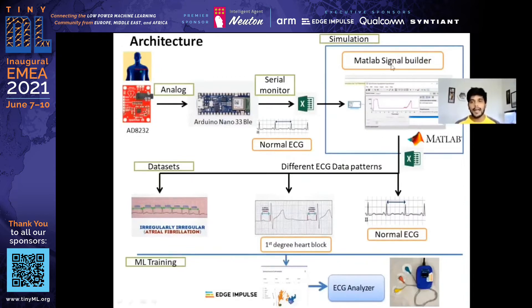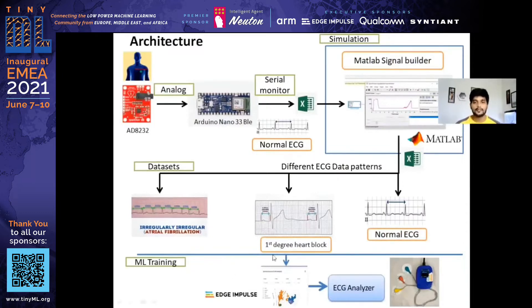I used MATLAB Signal Builder to modify the normal ECG data to look like a first degree AV block and irregular heartbeat like atrial fibrillation cases. Once all the data was ready, I used Edge Impulse software to do the model training, and within Edge Impulse I was able to deploy directly onto my Arduino board.